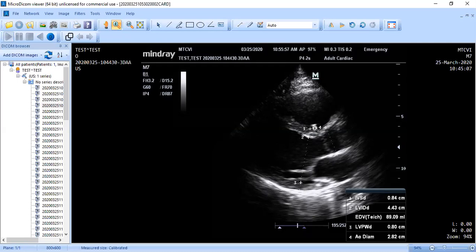So we're going to start right here. We want to make sure we get right on the line of the interventricular septum. You see this little area right here? This is a little portion of the commissure, or the annulus of the tricuspid valve, with what you can see right here. We don't want to include that in our measurement because it's not part of the interventricular septum. Oftentimes here you can see a little layer of the RV muscular portion of the wall, and we don't want to include that either. So it's very important we try to get right on the line where we see that interventricular septum come in.